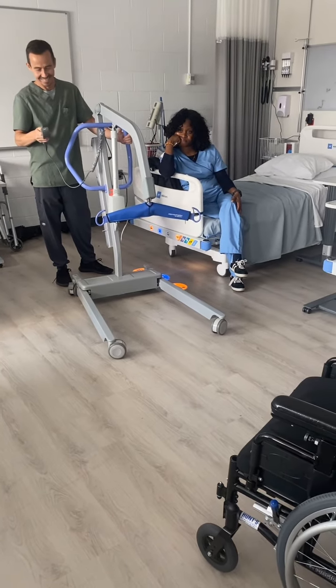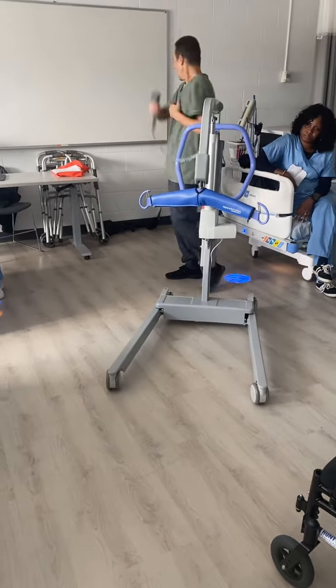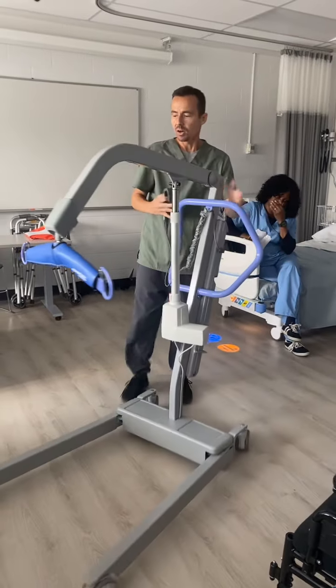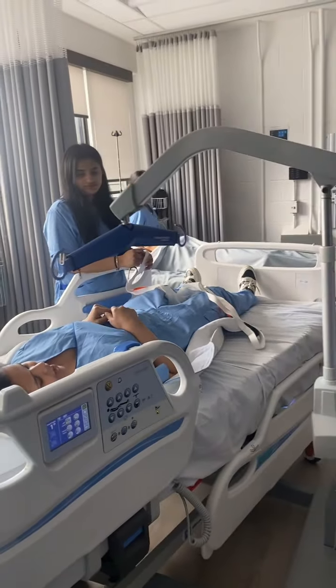No, I'm just shaking. Because I am kind of scared. Okay. I always do this, the patient is doing, but I'm doing it myself.